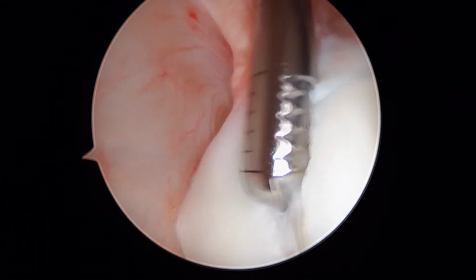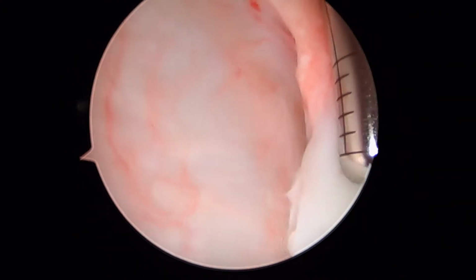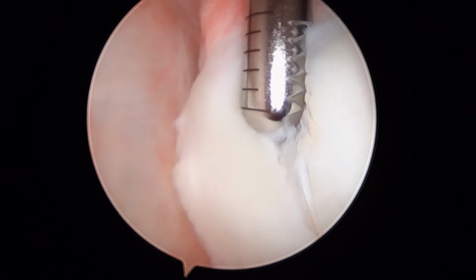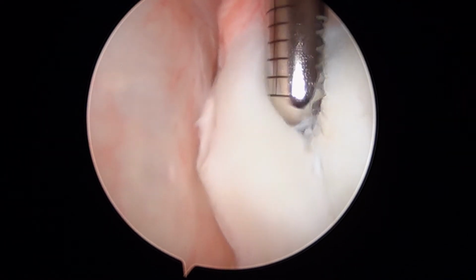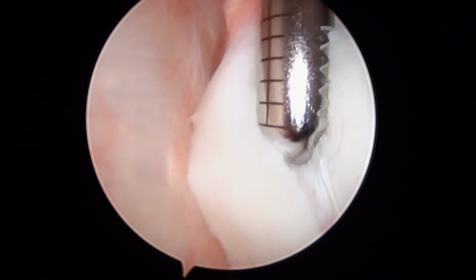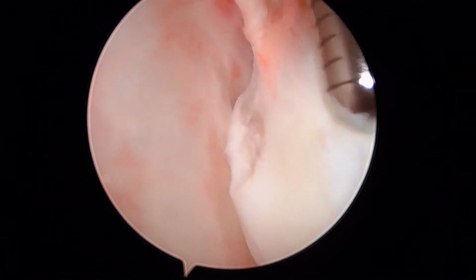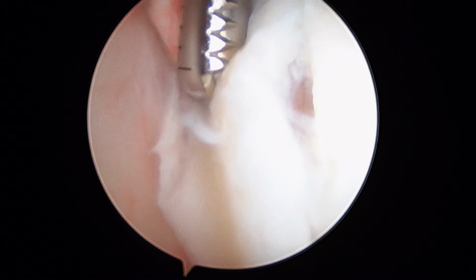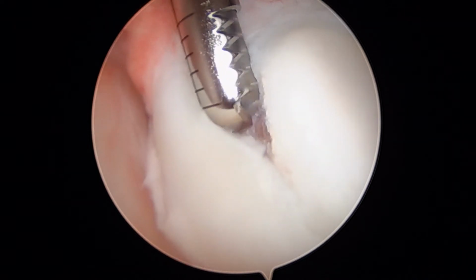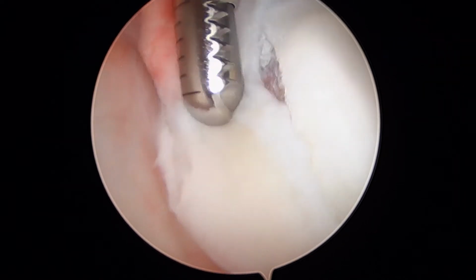Okay, so what we're doing here is we're using our shaver to remove the cartilage. This is an important step if we're going to be reattaching this labrum. As we rotate around, you can see that there's cartilage here all the way over the top of the glenoid. So that's not going to repair or heal down to cartilage. We've got to expose the bone below. And we'll know the difference because the bone starts to look reddish or even yellowish. You can see it there. Now we're down to bone. And taking off that cartilage is a critical part of the labral repair in this part of the shoulder, because we need to have something to heal to.